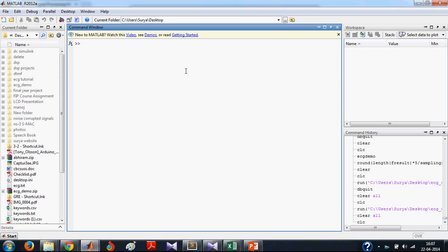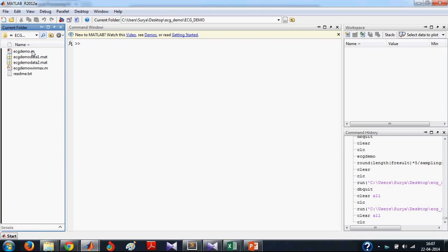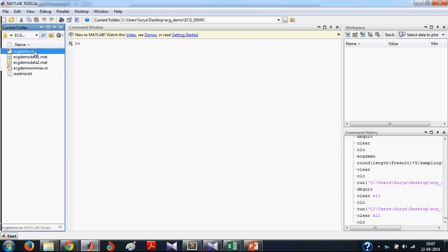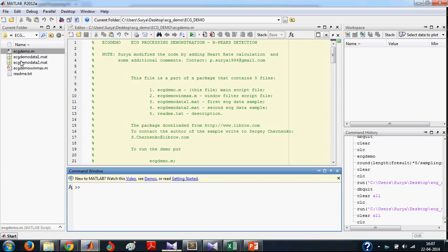After opening MATLAB, you have to go to the directory where you downloaded the code. And then to open this .m file, double click it. To run the code, just type ecgdemo.